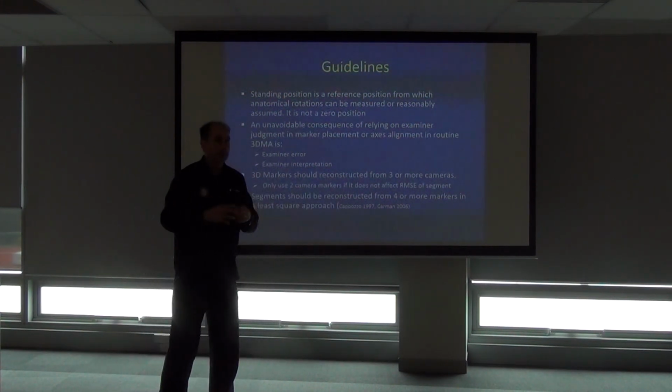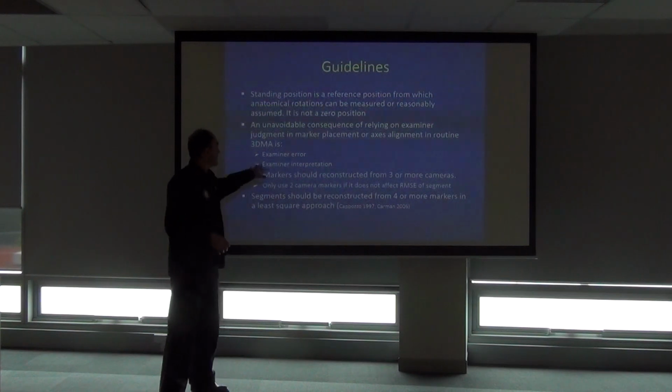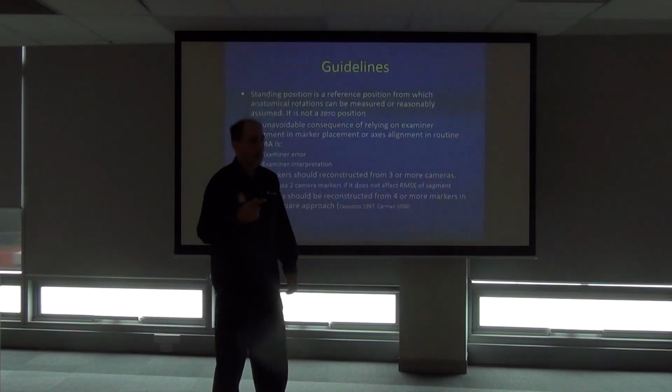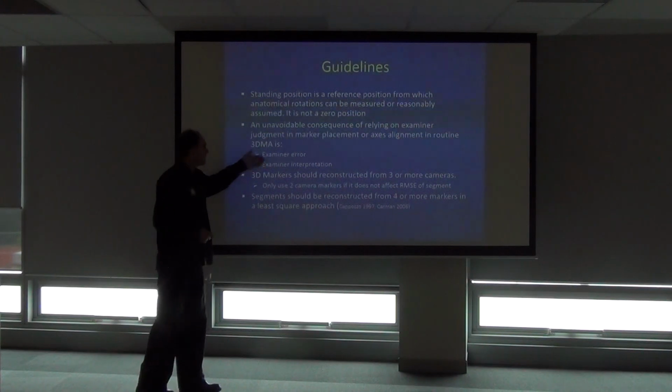They're 2 different things. The implementation comes down to part of it being the setup and the cameras, but part of it is the examiner's interpretation of the model. So what they think they're supposed to be doing might be different from what someone else thinks they're supposed to be doing, or where they should be putting markers. So you've got the error and then you've got the interpretation.